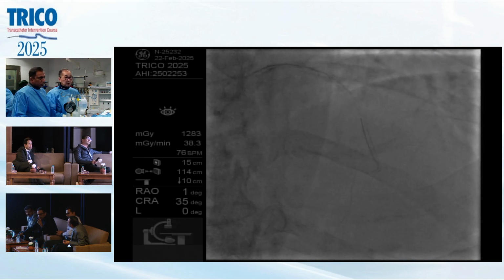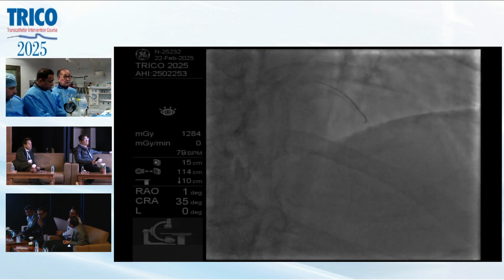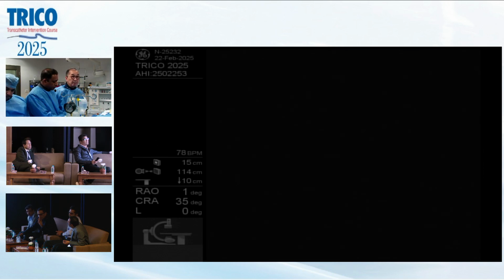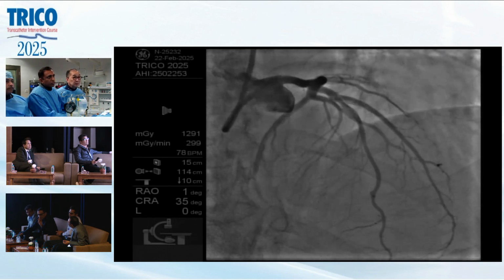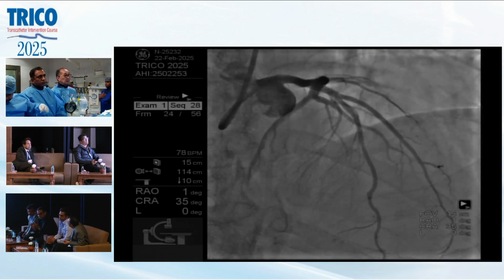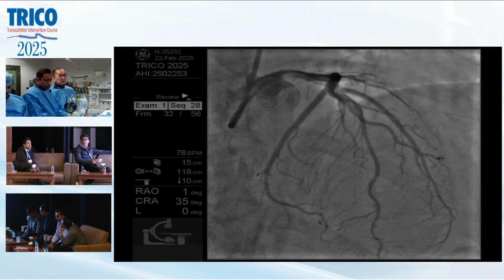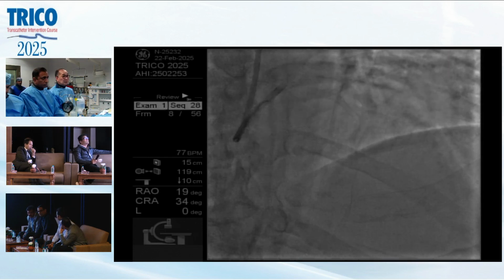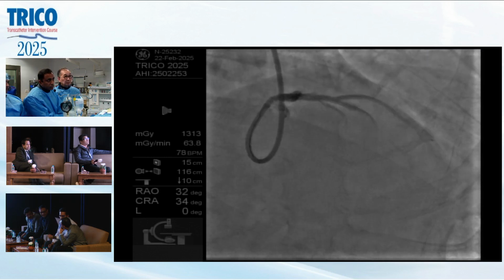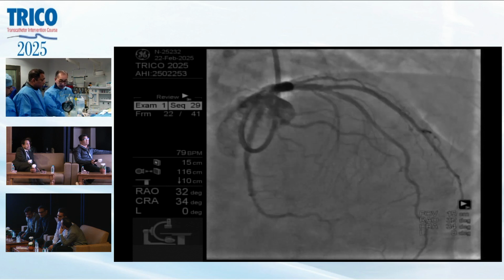Maybe the wire is causing more artifact. So, okay, let's see. Ready? Okay. All right. So we make similar. Okay. I think I leave it alone.